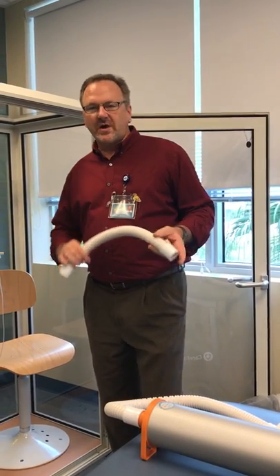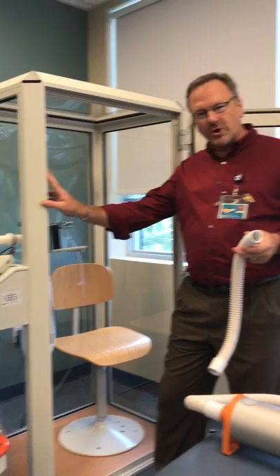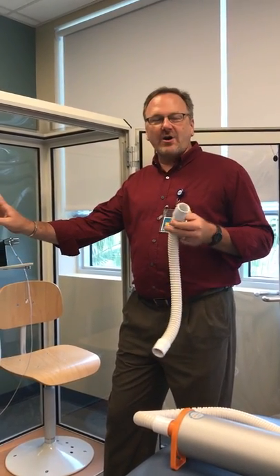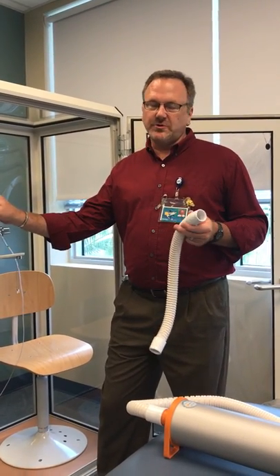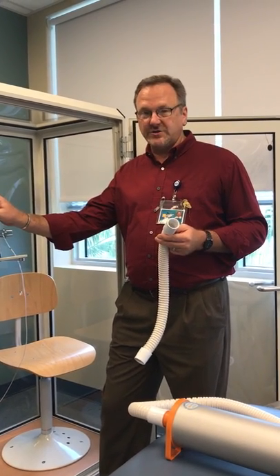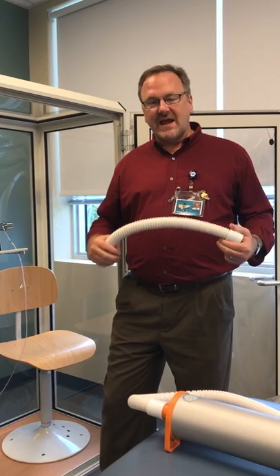This video is to show you how to actually physically set up the plethysmography box, partly for the test and also partly for the calibration. You should have already watched the video on how to do the computer portion of the calibration. This is how to set it up for the test and the calibration.